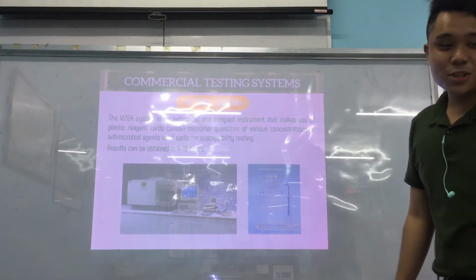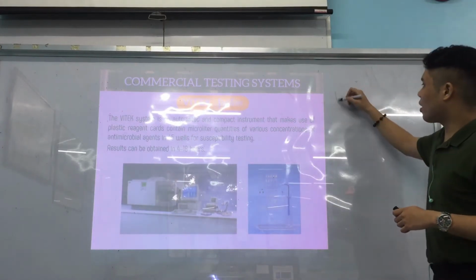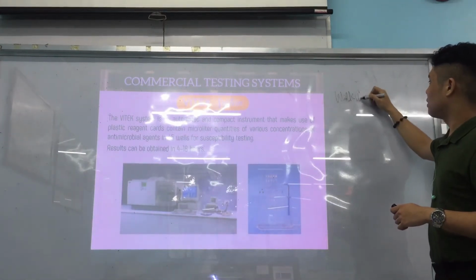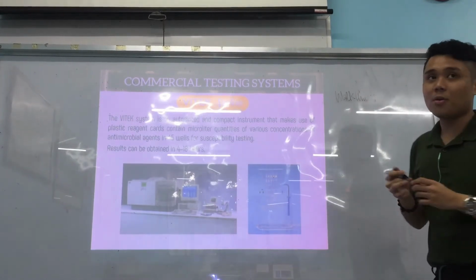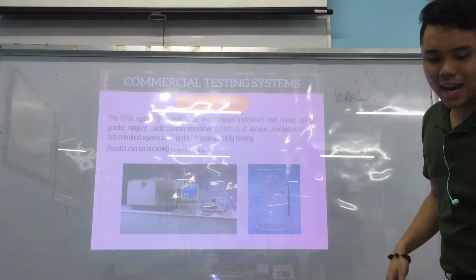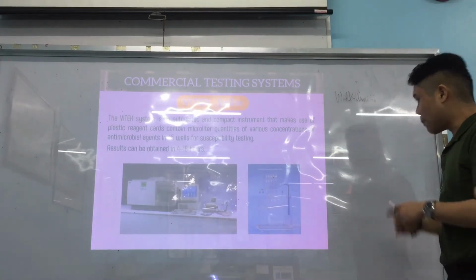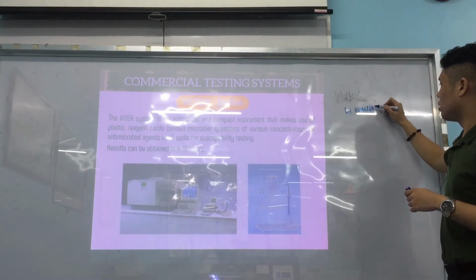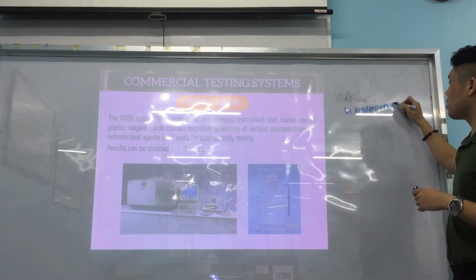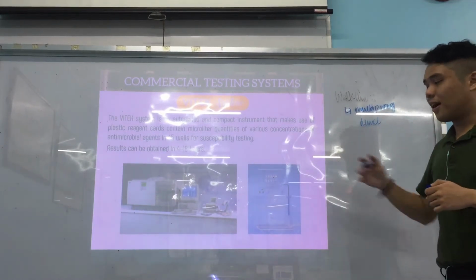Okay, all right. So that's the last for commercial testing systems, the Vitek system. We also have the WalkAway scan. Now, the WalkAway scan is still the same principle as Vitek, but it uses a multi-prong device. You manually inoculate your wells.